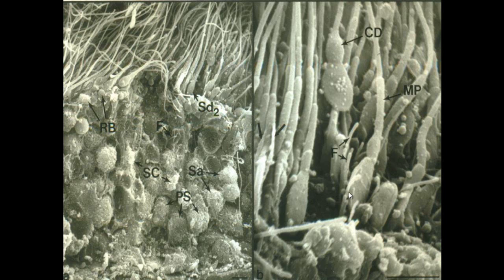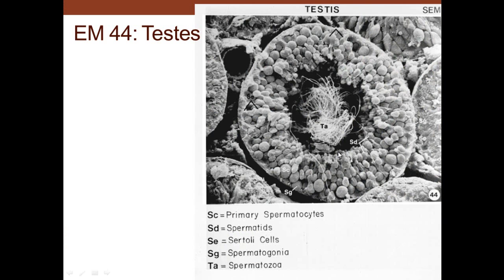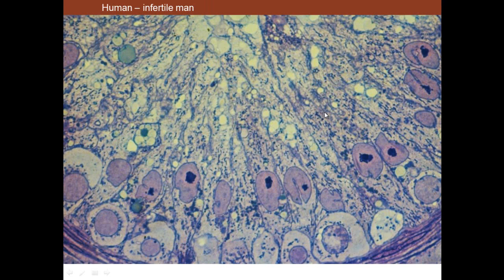And you can also note the next generation, so if these are seniors, then these would be juniors. The younger spermatids, the ones with the round nuclei, are projecting out into the lumen, and here we see the mitochondria-swollen middle piece of the mature spermatids, and the younger spermatids, a little bit of tail flagellum that we see there. And so if we look at a scanning EM of the testes, we can see there's a host of germ cells and almost always have some sperm in the lumen.